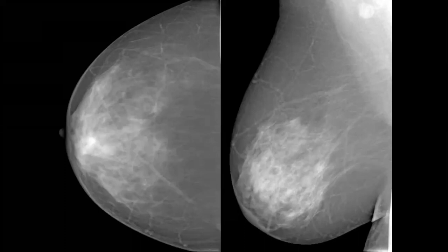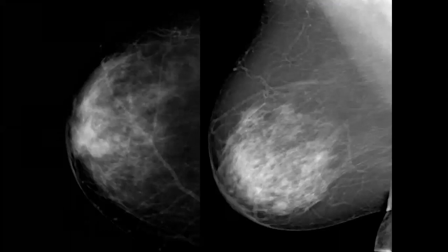So you have spot compression. When you have seen asymmetry or focal asymmetry, you have to describe if there is any associated features. Yes, associated with focal retroareolar skin thickening. So you have to do spot compression view for this area, if not done, and an ultrasound. So you are going to report it as asymmetry with associated retroareolar focal skin thickening and axillary lymph node enlargement. This is suspicious. You have to do ultrasound and do it by BI-RADS 4.